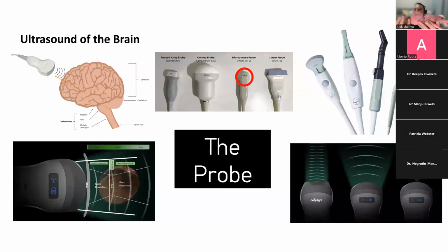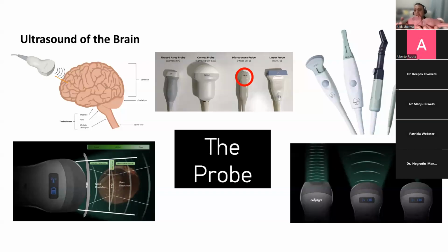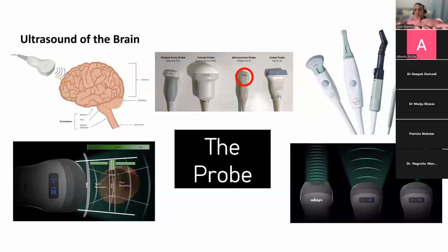So as soon as I want my frontal lobes, okay, I've got my frontal lobes. There are no frontal horns visible. Okay. I can see some brightness. It's too bright. I need to reduce the gain. Auto. But can you see how my probe has not moved?